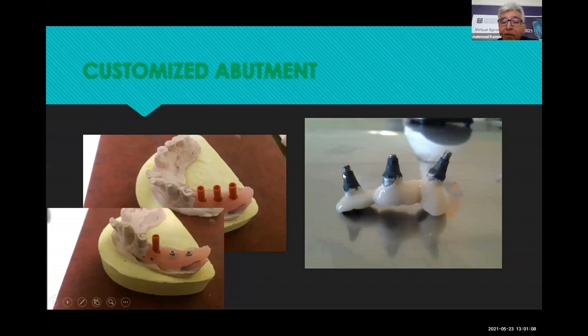The oxidation needs to be cleaned and polished after casting, and all of these make its intimacy a little bit lesser than it should be for connection to the implant. So we have a little micromotion in the implant with this UCLA abutment.